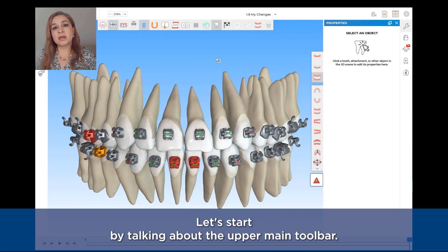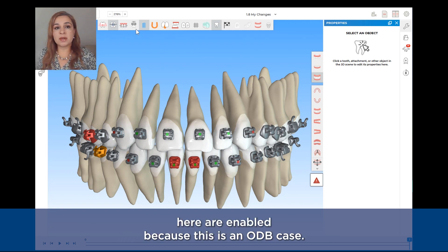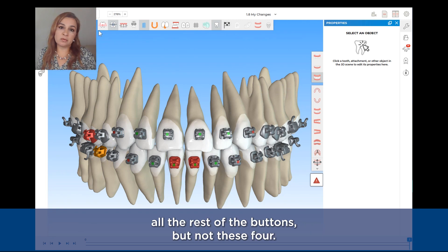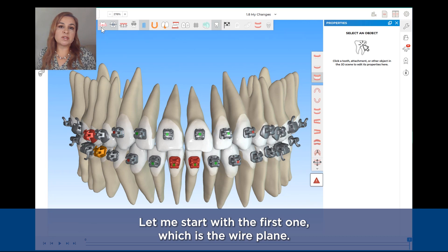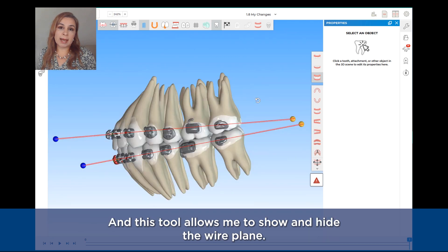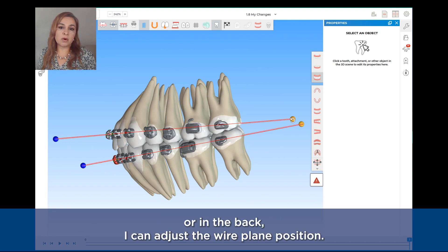Let's start by talking about the upper main toolbar. These first four buttons are enabled because this is an OTP case. If this was a SPARCA Liners case, I would see all the rest of the buttons but not these four. The first one is the wire plane. This wire plane helps me to see where the brackets are going to be positioned, and this tool allows me to show and hide the wire plane. By using these control points in the front or in the back, I can adjust the wire plane position.